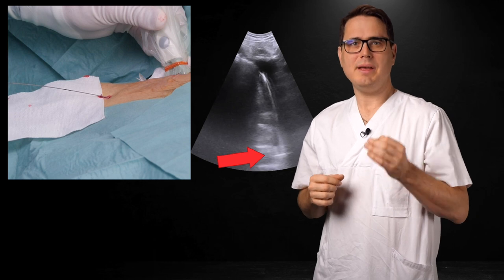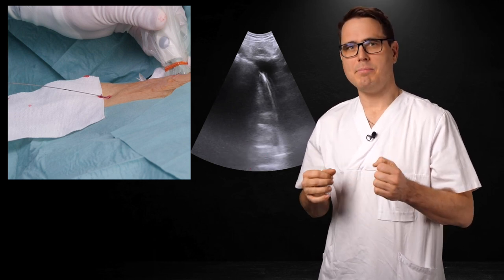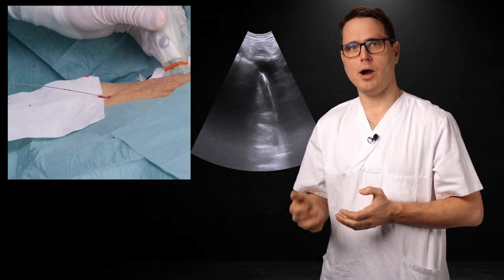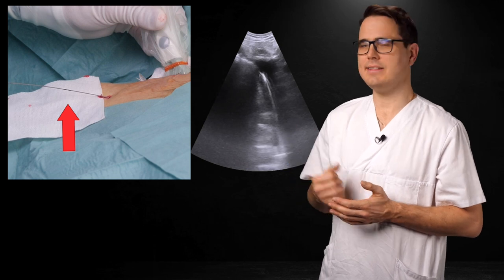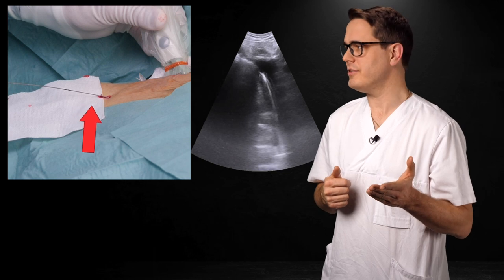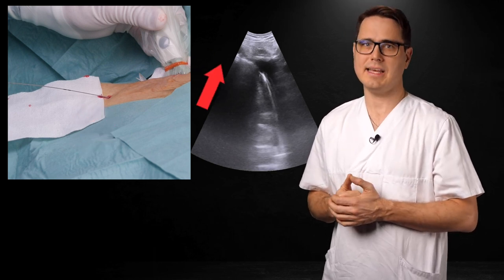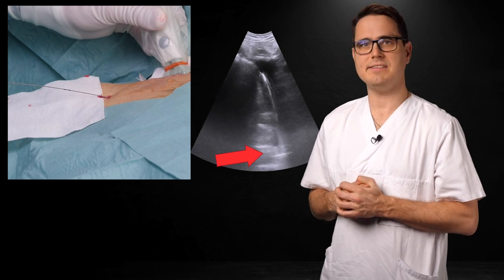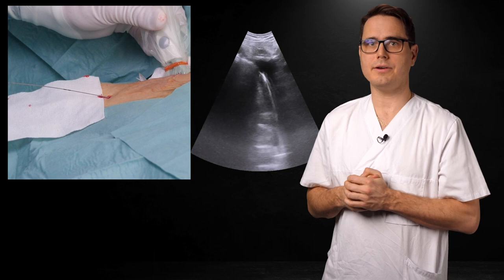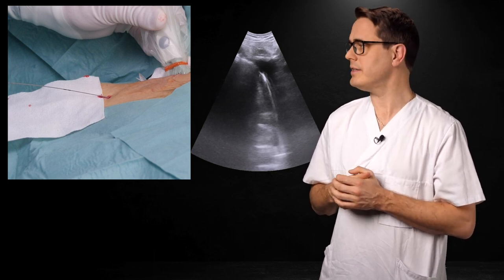So, the J-tip is in position. At this point, take a look at the guide wire depth markings in order to gauge the distance from the skin puncture to the RPA. You can clearly see the 20 centimeter mark against the gauze — it's approximately 5 centimeters from the skin. So it follows that the distance from the skin to the RPA is 15 centimeters. Therefore, if you insert the catheter 15 centimeters, its tip will end up in the perfect location.